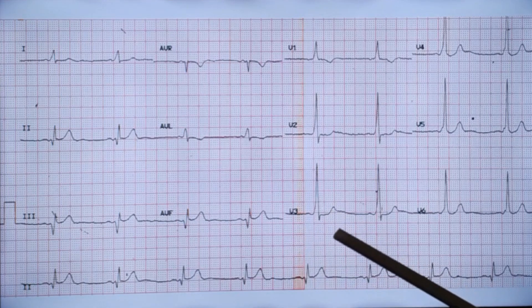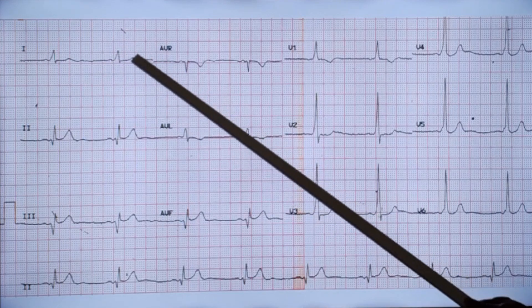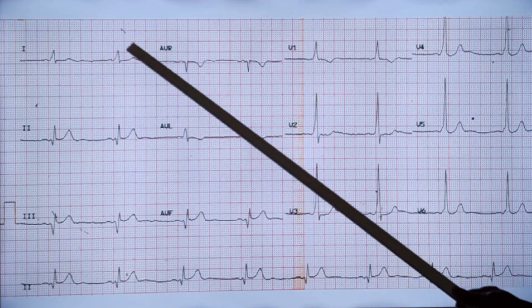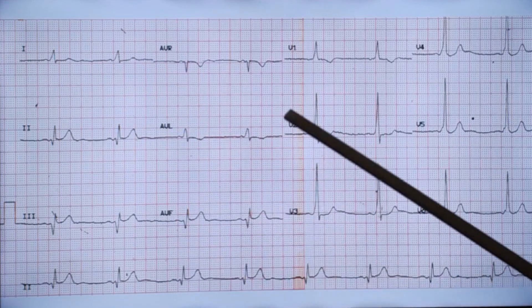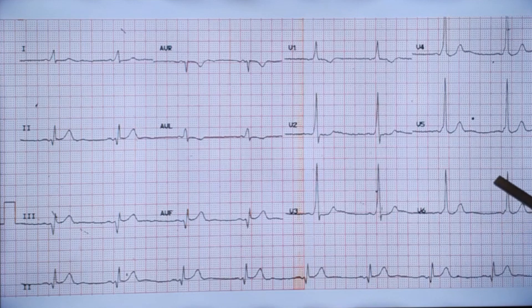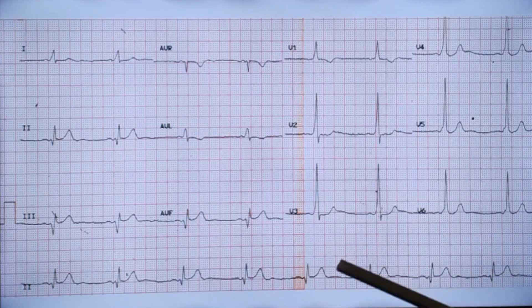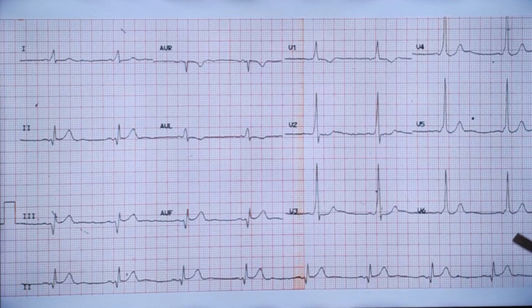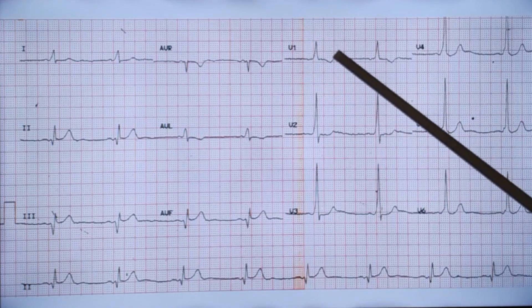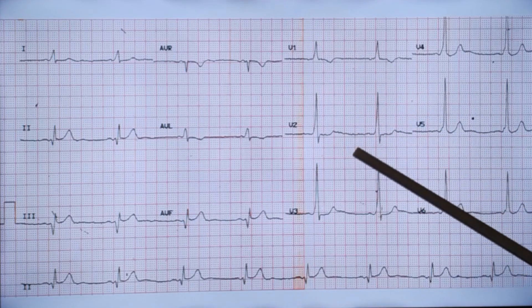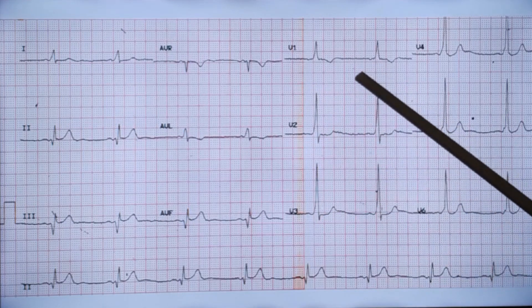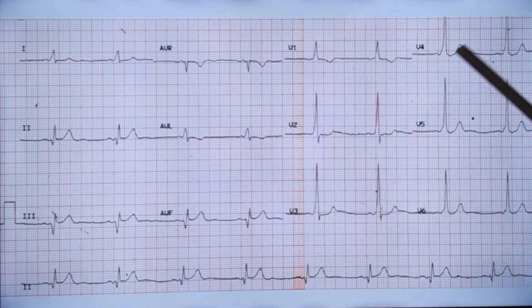This ECG could also resemble left bundle branch block because at one glance you might think this is left bundle branch block with a wide QRS and R wave in lead I. If the delta wave were a little more prominent you could mistake it for left bundle branch block. So WPW syndrome can be mistaken for infarction, bundle branch block, and since the voltage is high you may also think of left ventricular hypertrophy due to the tall R wave. Similarly, there is a tall R wave in V1 which might suggest right ventricular hypertrophy. So WPW can mimic hypertrophy, infarction, and many other conditions.